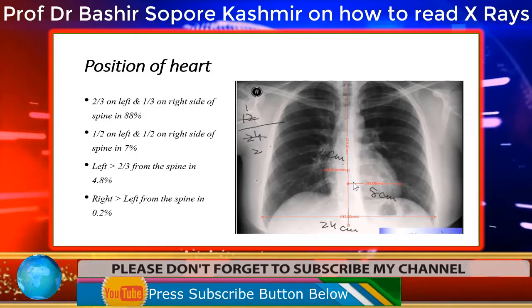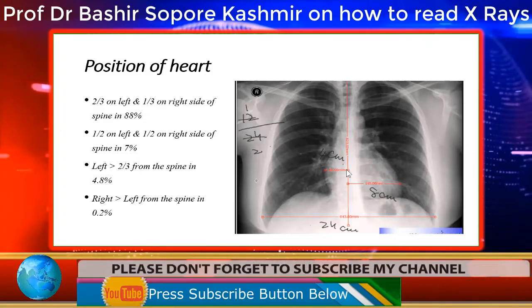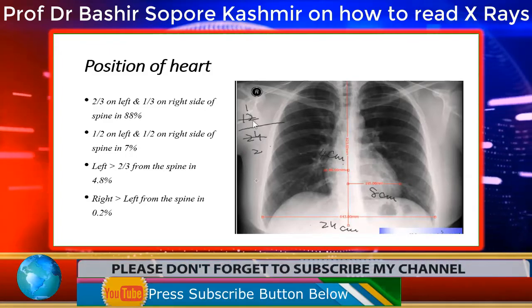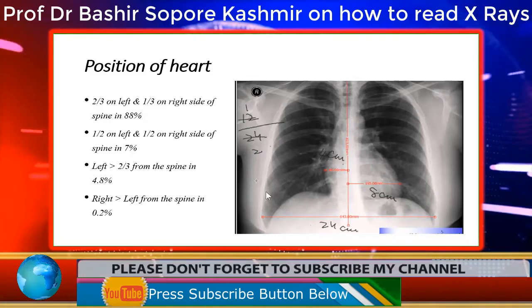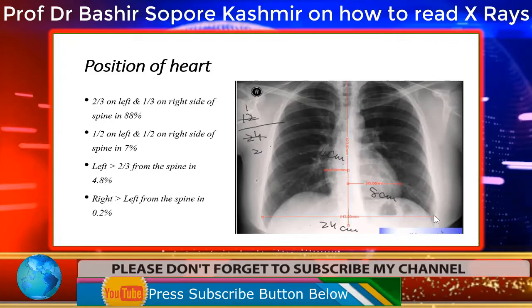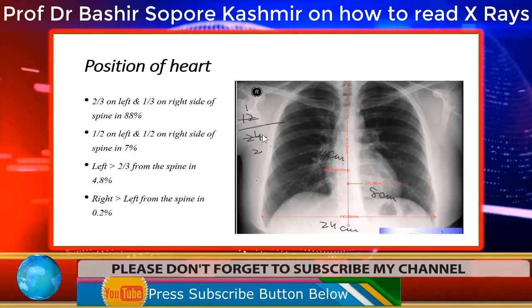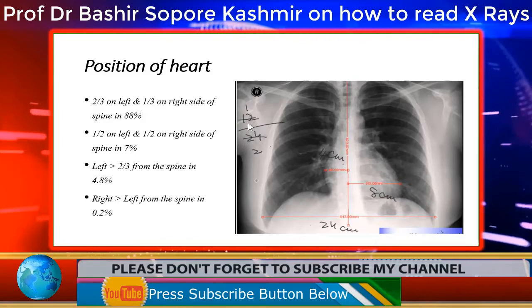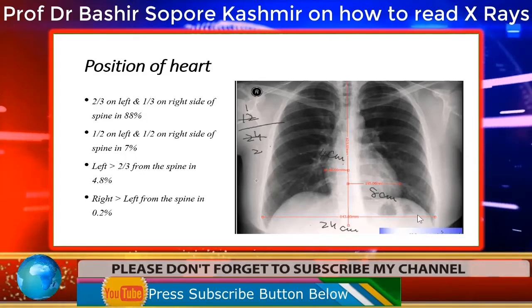Now suppose we measure and we find that this lateral two-thirds is 8 centimeters, and on the right side the one-third is 4 centimeters, then you add 8 plus 4 is equal to 12, and divided by the distance across the chest wall. So you take the maximum distance across the chest wall horizontally like this. So for example, if it measures 24 centimeters, then 12 centimeters divided by 24 is 1/2. So that means it is 50%. The cardiothoracic ratio is 50%. It is within normal limits.